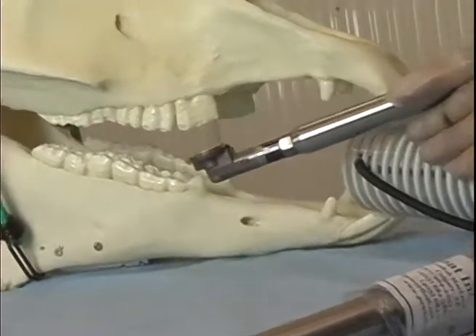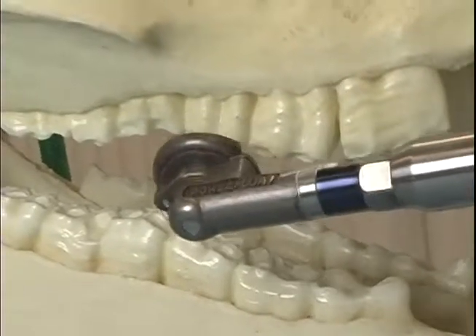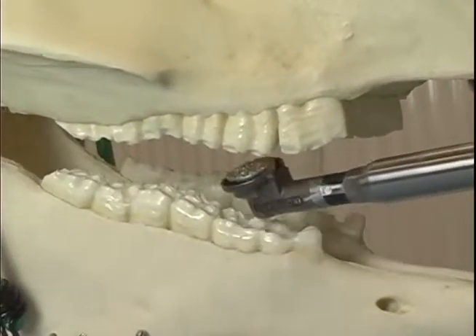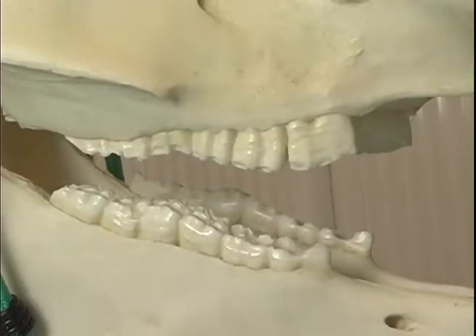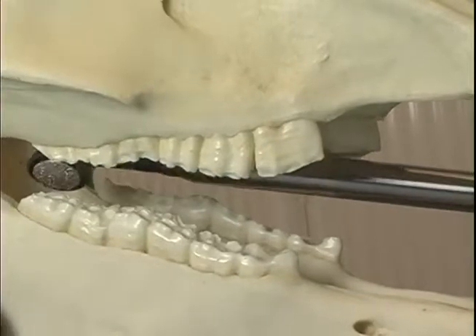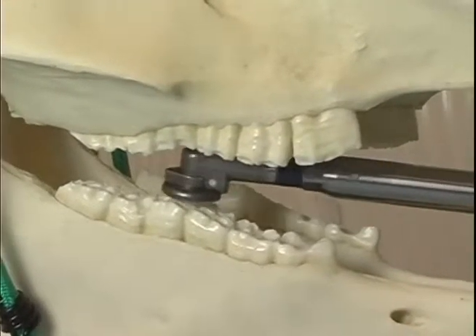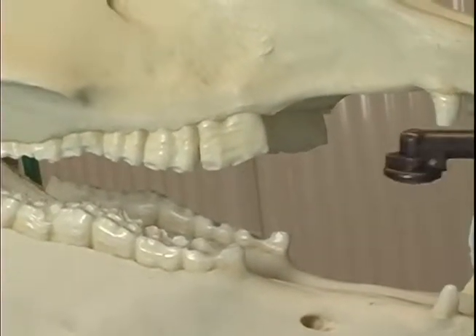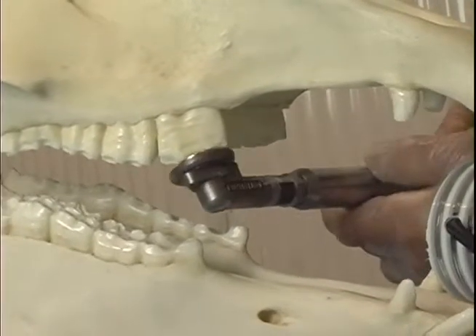With the right angle grinding tool, you can get sharp enamel points, but you see that the right angle is sticking out against the cheek much further, so it's a little harder to push out the cheek at the back of the mouth. It is used to access the chewing surface anywhere, top or bottom of the arcade. A lot of times when you go in, you're able to access the back of the mouth here by rotating it on, and you should be able to visualize the wheel going onto the tooth. So it is used to reduce the table surface of the teeth. I also use it in the mouth sideways for smoothing the front edge of the teeth, as in bit seat.